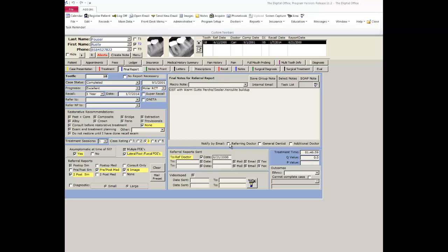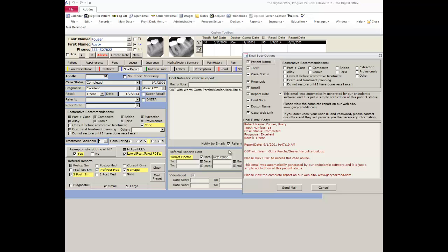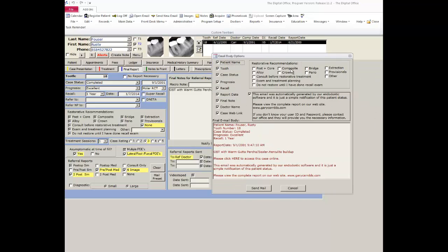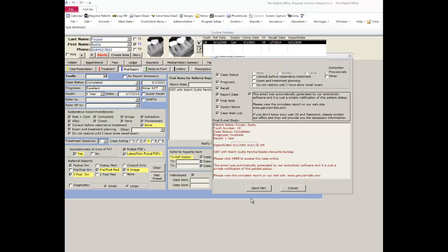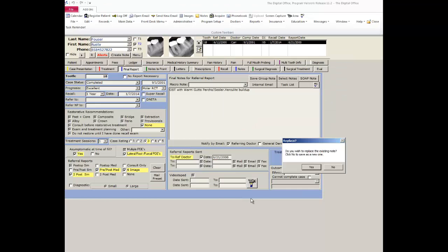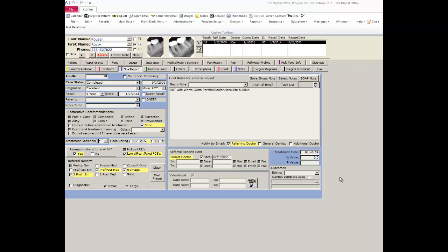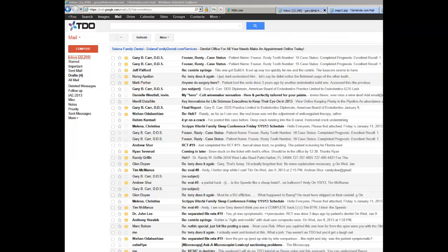I'm going to notify the referring doctor that I have completed this case. When I check that box, a screen comes up showing me what's going to go on the text-only email that goes to the referring doctor. I send the email. It instantly is sent to the referring doctor. As soon as that referring doctor checks that email, they will be able to access that case information. Let me show you how that looks now.